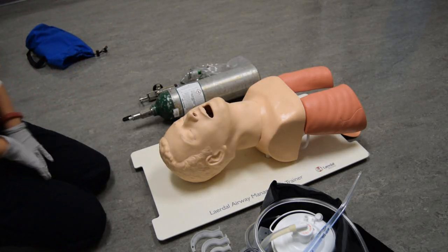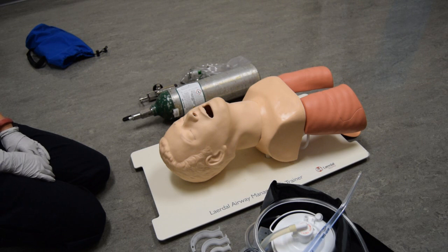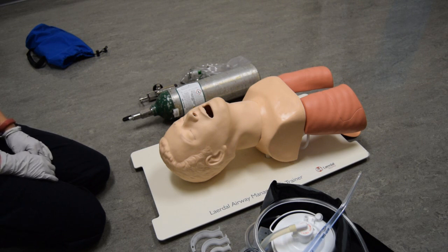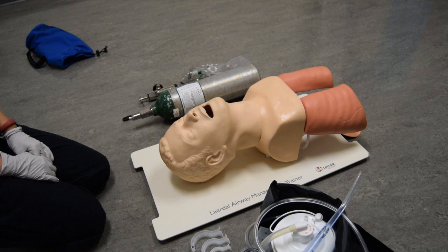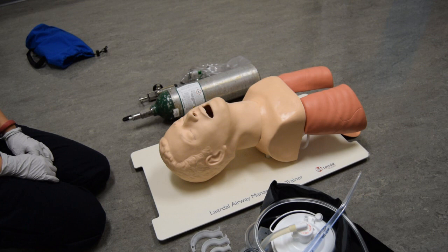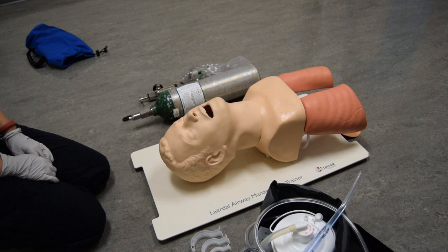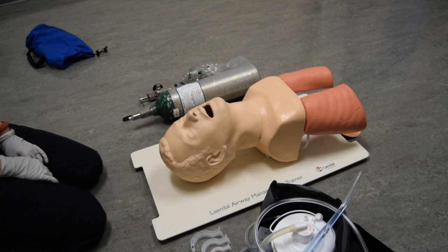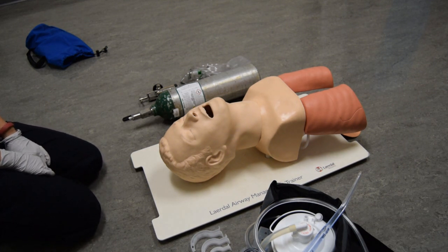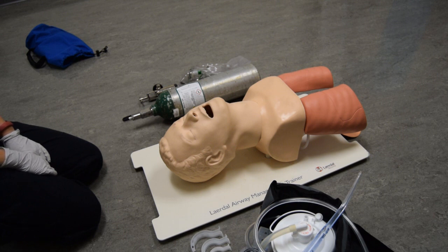Instructions to the Practical Skills Candidate for Oxygen Administration by Non-rebreather Mask. This skill is designed to evaluate your ability to provide supplemental oxygen administration by non-rebreather mask to an adult patient. The patient has no other associated injuries. This is a non-trauma situation and cervical precautions are not necessary. You will be required to assemble an oxygen tank and a regulator, then administer oxygen to an adult patient using a non-rebreather mask.